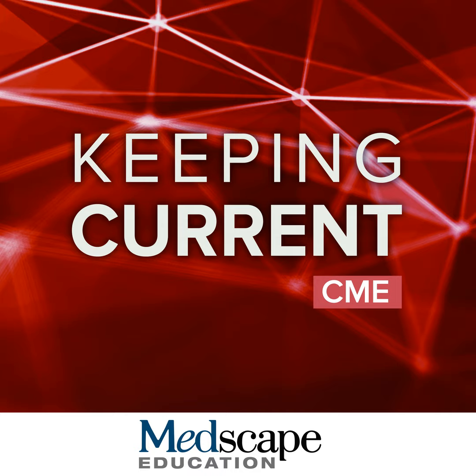And finally, the last thing I wanted to mention is, I told you earlier that when we consider whether we want to give contrast or what contrast we want to use, we look at many elements, but one of them is patients who are going to get repeated MRIs in the course of their life. So an example is multiple sclerosis patients. We know that they are typically going to get a lot of MRIs in their life at regular intervals. They tend to be very young patients. And so, of course, that's a perfect example of a patient population where we try to minimize the use of contrast because, again, they are going to get many MRIs over the course of their life.